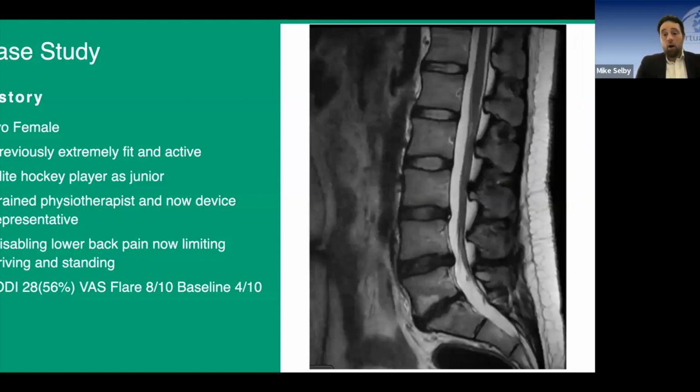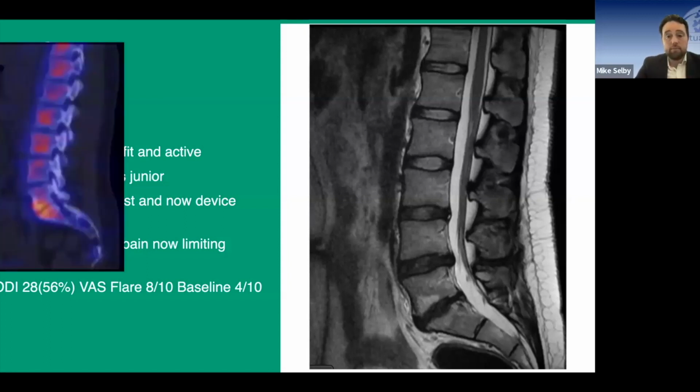And this is an MRI that the spine surgeon sees, and your heart sinks because there's no major neural compression. It's not isolated single level disease. There's no spondy. So our traditional indications for surgery really are not there. This is 3-level degenerative disc disease with otherwise relatively normal alignment. And this is an incredibly tough problem to treat surgically.